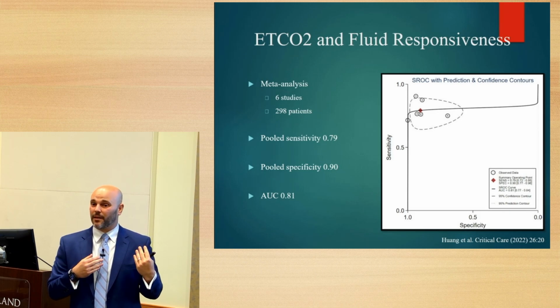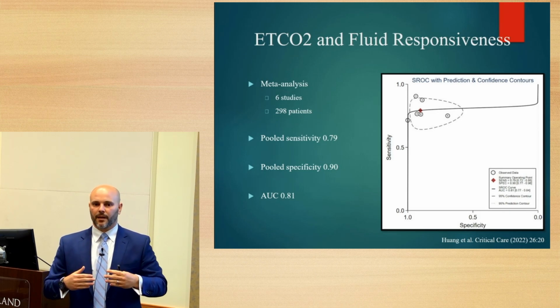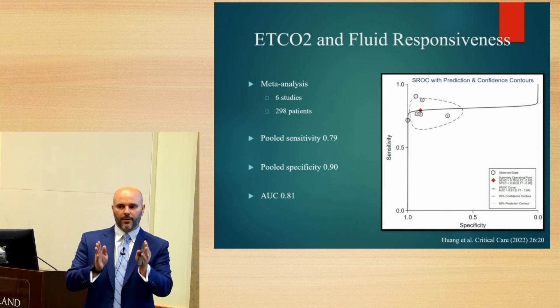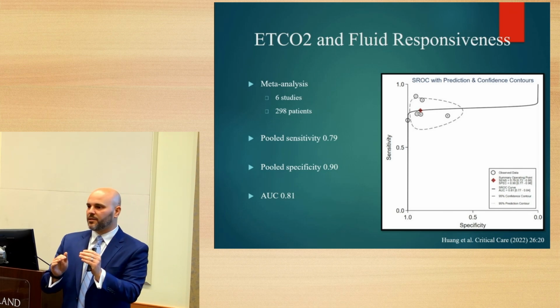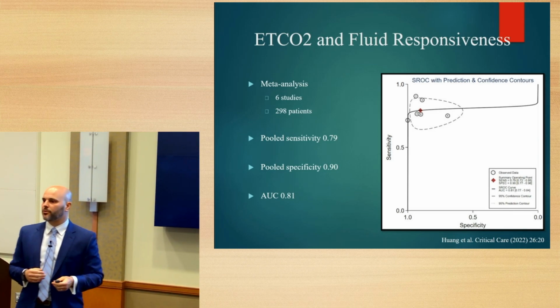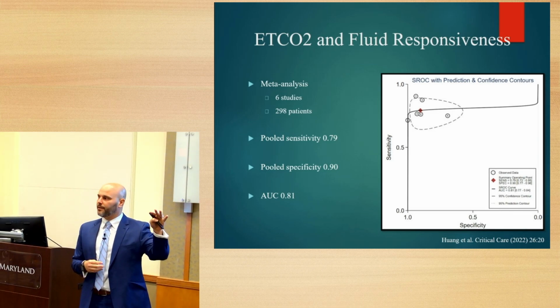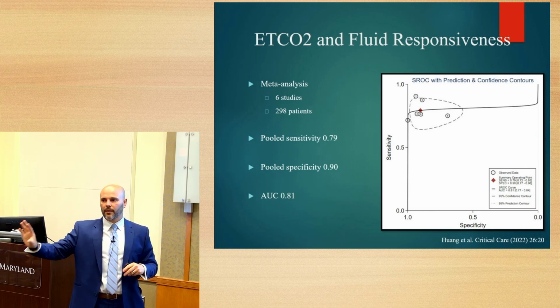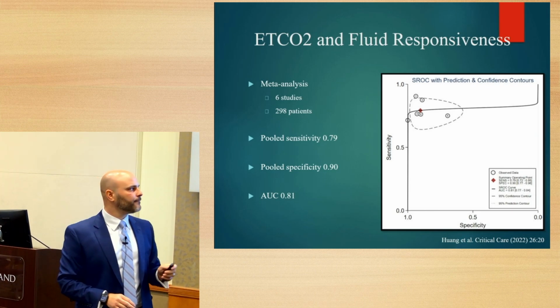So ideally, these patients were all intubated to give you a very consistent tidal volume and consistent dead space. And also their metabolism was relatively unchanged as well. So controlling those two pillars from the journey of CO2 slide, we can kind of isolate cardiac output and then fluid challenge based off of that. Okay.